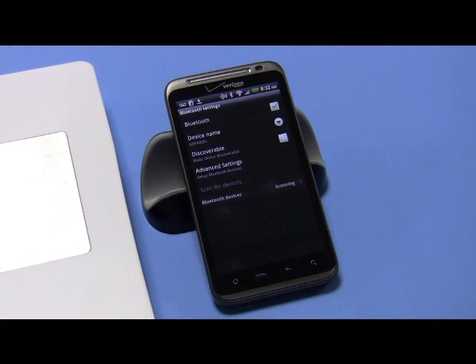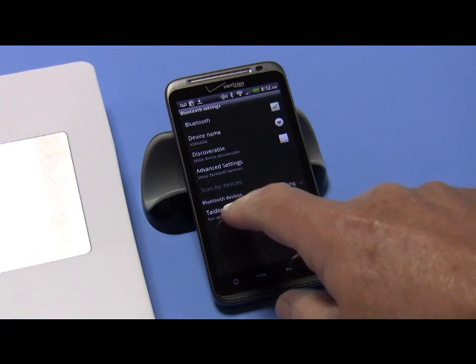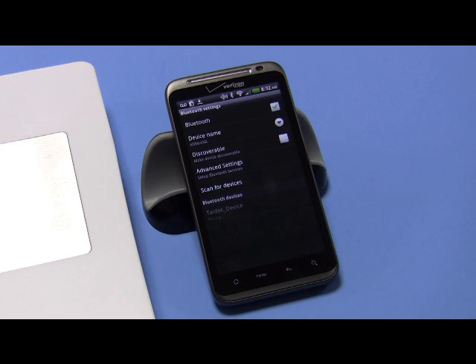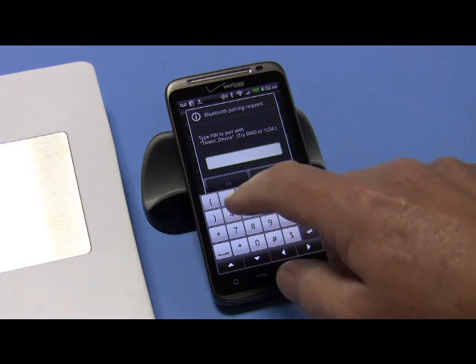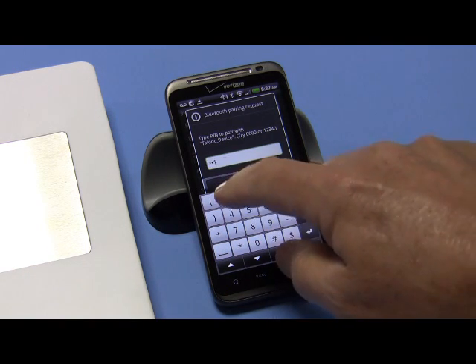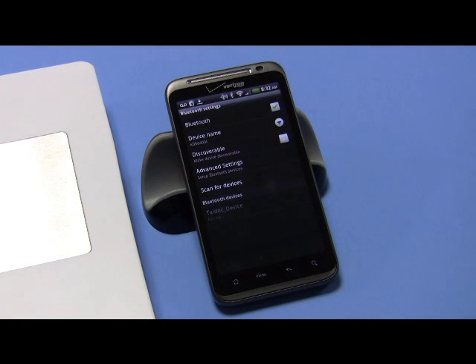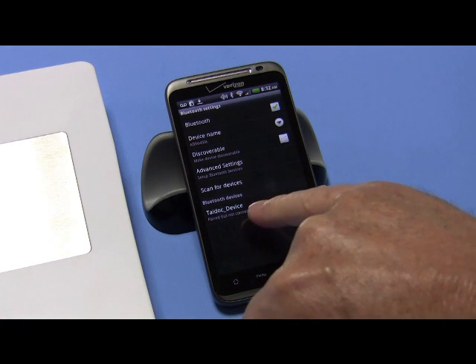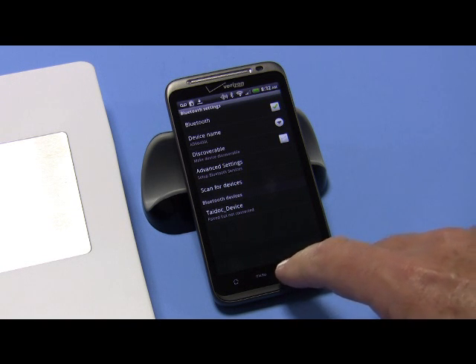Scanning — there it is, the Tie Dock device. You see that? So let's pair with that device. It's asking you to put the numbers in, so it's six ones — one two three, one two three, that's six of them. Hit OK, and you see it says 'Paired but not connected.'